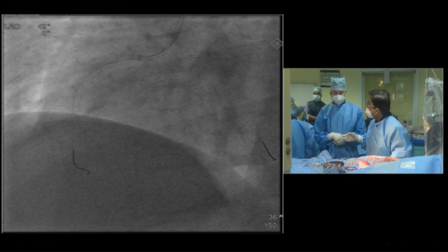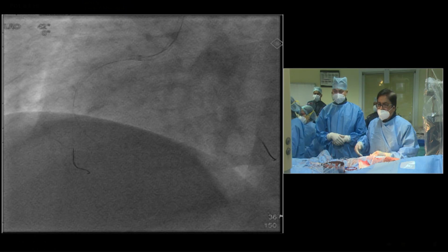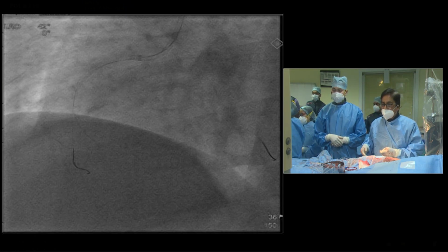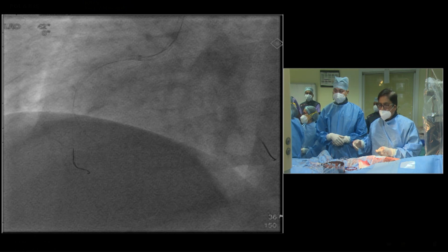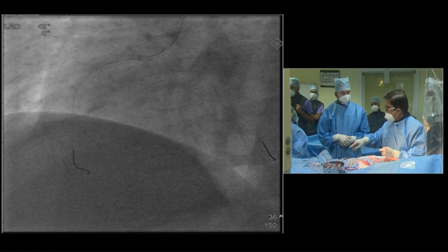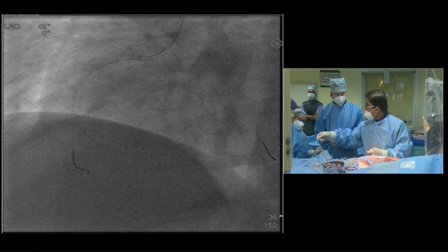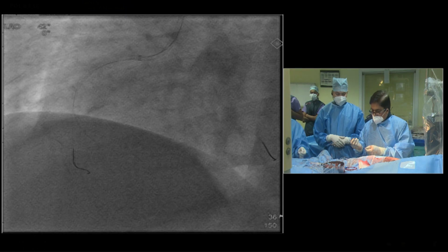Yeah, so I think nothing more in the chat box, except for Dr. Ramdev, who's been pretty active since morning. Again, the question of nitrates, I think we've already discussed. We don't want to give nitrates to grow this vessel. Despite giving nitrates, sometimes even at the end of the procedure, after you put your stent, the distal artery would look a bit not dilated, it would look undergrown.